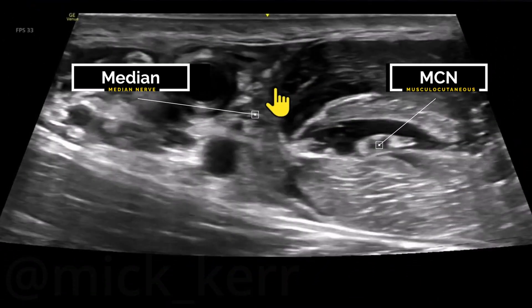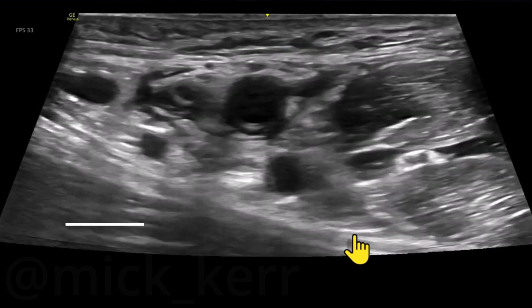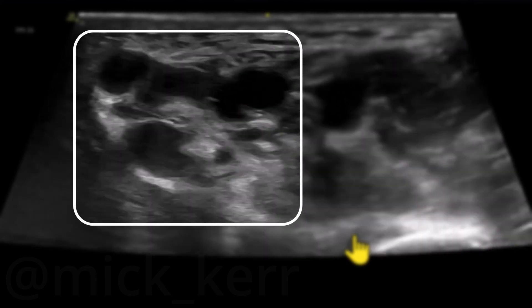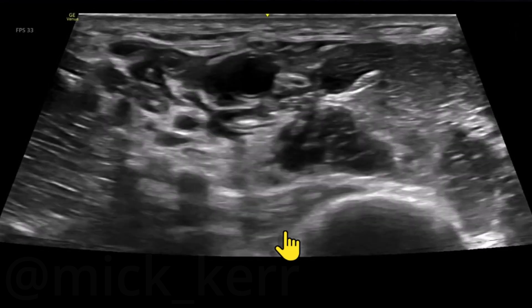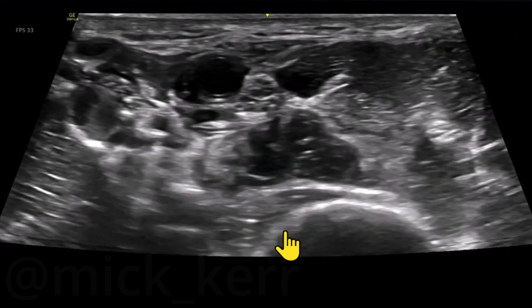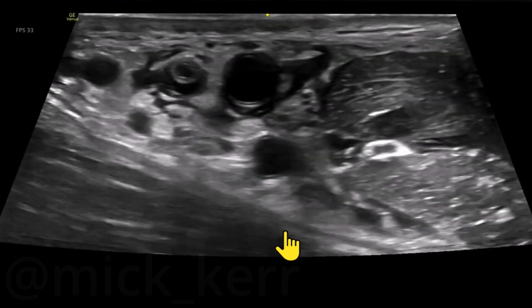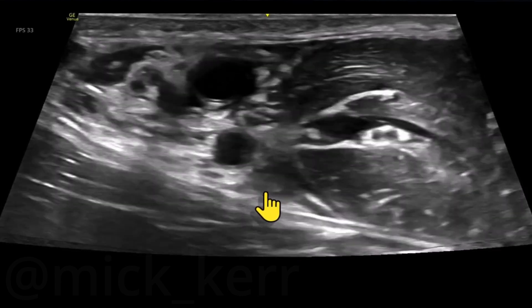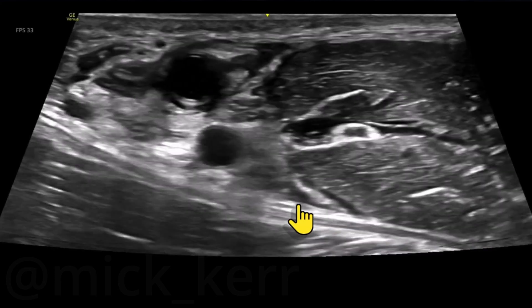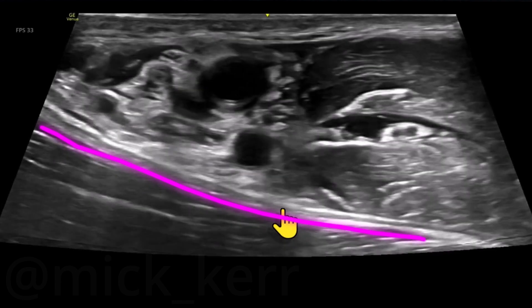I'm flicking around now — we've got musculocutaneous, we've got the median nerve there, and the ulnar and radial are the ones I'm looking for now. Pause there — the ulnar nerve is out here. It sort of gets lost in the grey, but you can see it at different spots. I get the feeling that a little bit more local sitting above the conjoint tendon would be a good idea here.